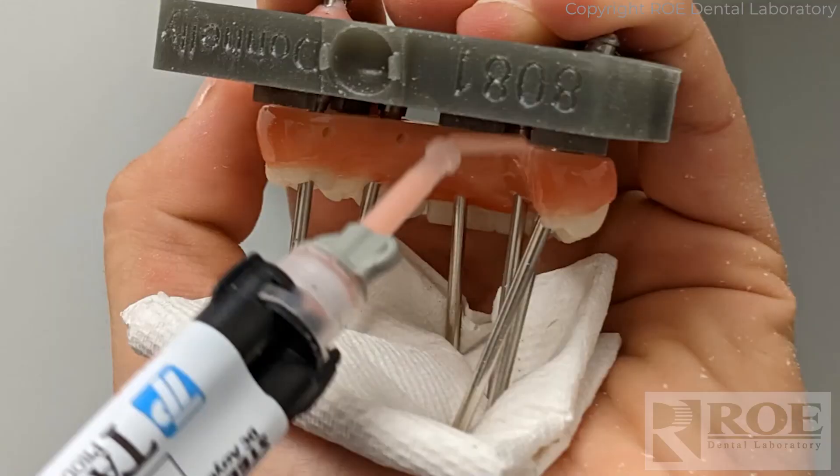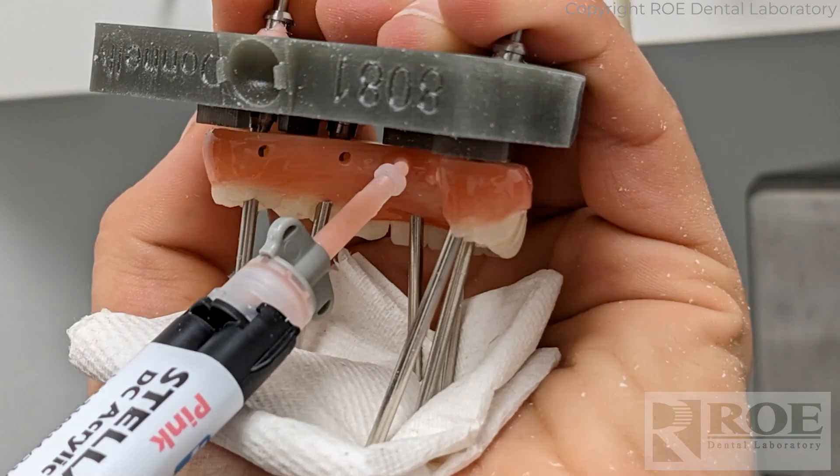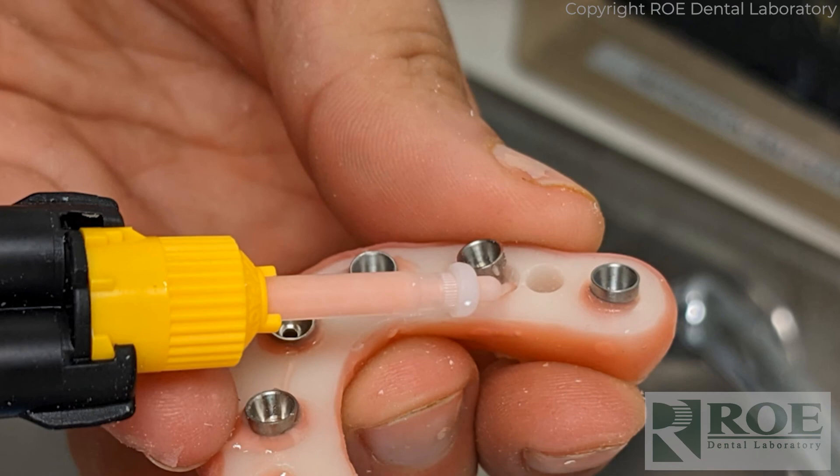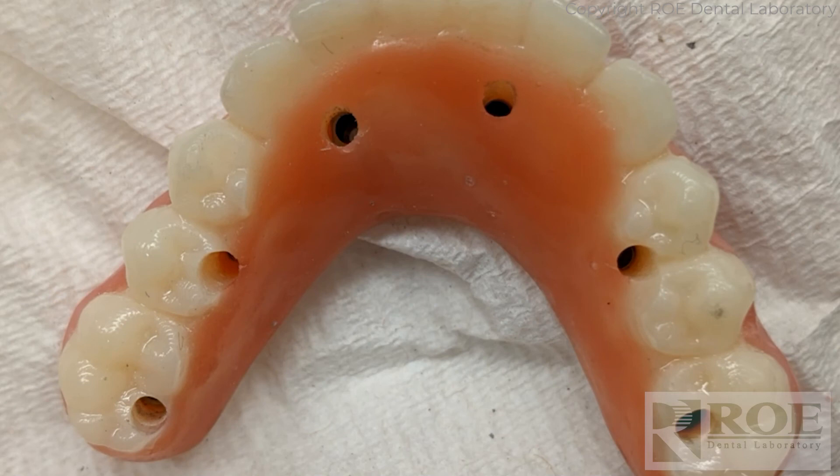Then we use the injection ports to connect the temp cylinders to the prosthetic. Unscrew the prosthetic from the model — now we've picked up the copings — and then go back through and backfill and clean it up. Fill the voids, fill the carrier guide hole, and get the case ready for delivery with small holes — just like that.